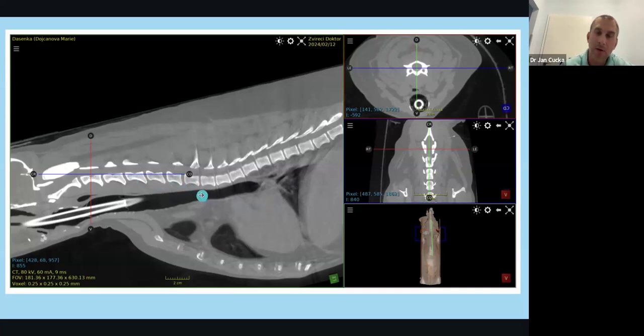There are some rules for how to judge intervertebral spaces. Usually you count 3 vertebrae, and you try to judge each vertebral space against the others, looking for narrowing spaces which are suspected for lesions.